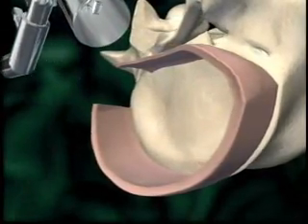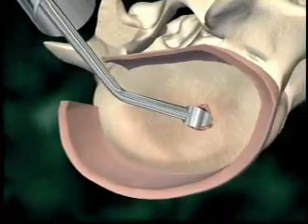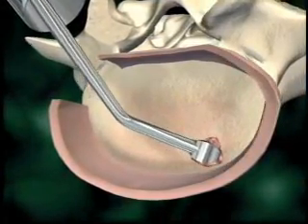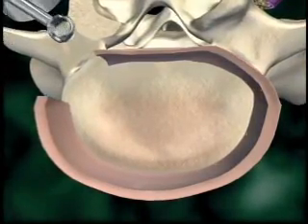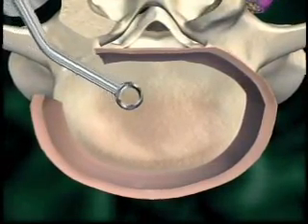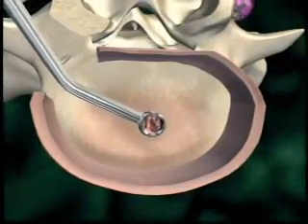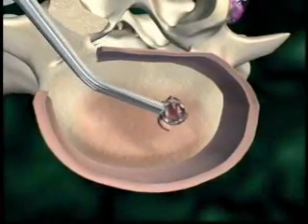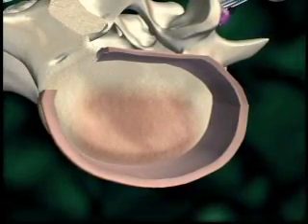Endplates are prepared using serrated curettes, ring curettes, and rasps.